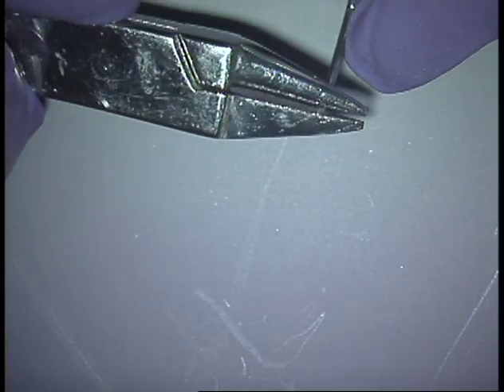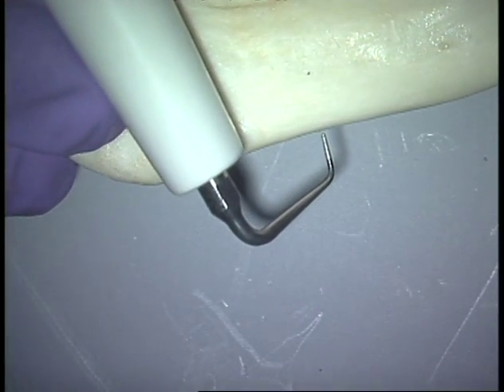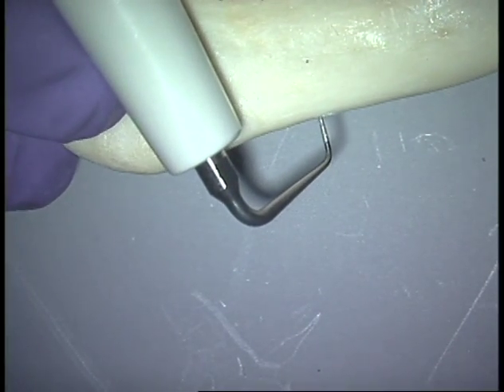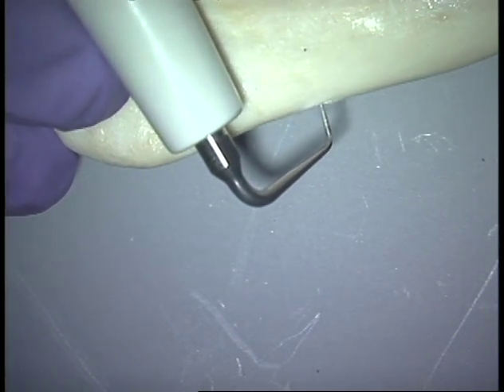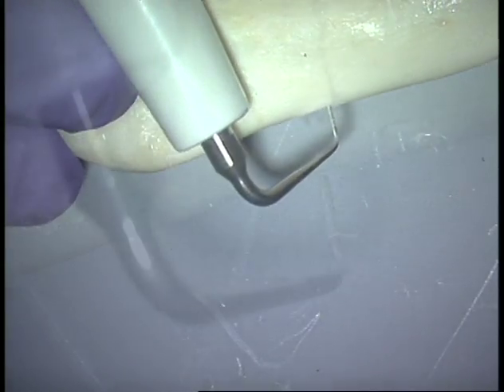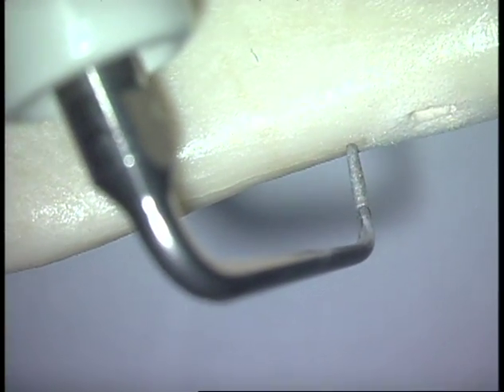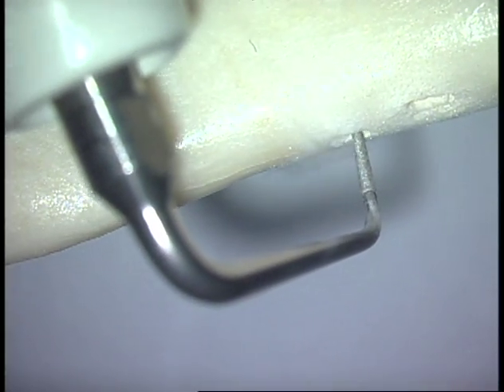Take the orthodontic wire benders, gently and gradually bend the tip to the desired angle, and that tip will now function as an ultrasonic surgical tip — custom-made to whatever bend that you prefer. You can do large bends or very, very small bends, and the tip will not break.